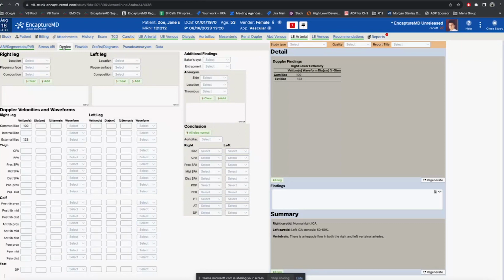One is that you're looking to find the velocity, so you're getting the velocities of all of these, and they're corrected for an angle. And then you're also looking for abnormalities, and so there's visual things. Is there a clot? Is there atherosclerosis? Is there various elements of thickening, or stenosis? And so you can comment on all of these.